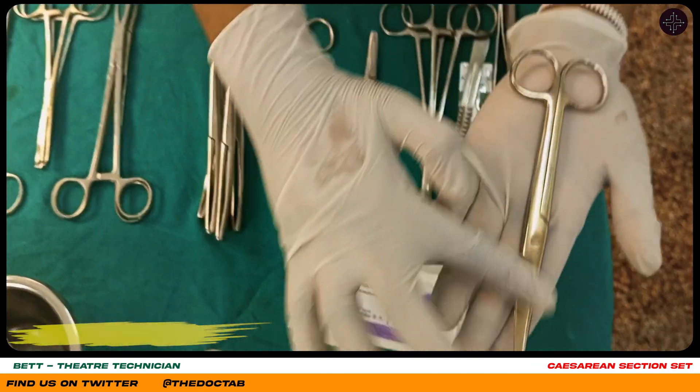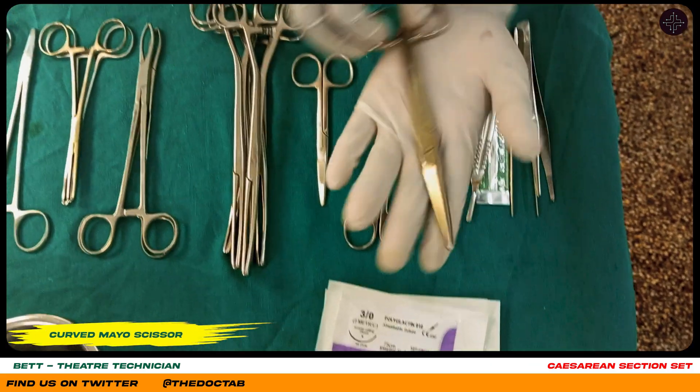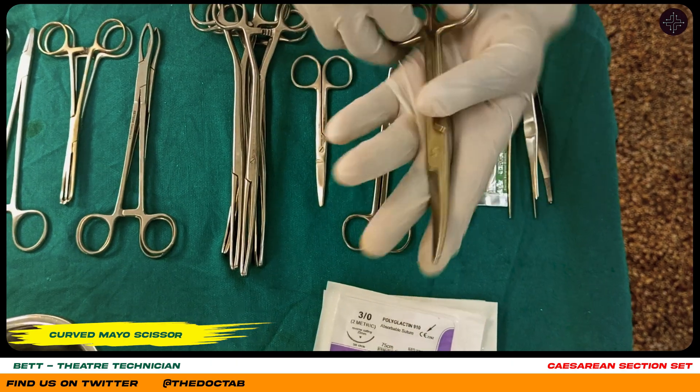Here we have — you can see it has a curve — so this is a curved mayo scissor, which is used for cutting the umbilical cord and other tissues.